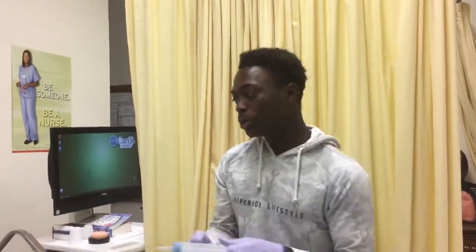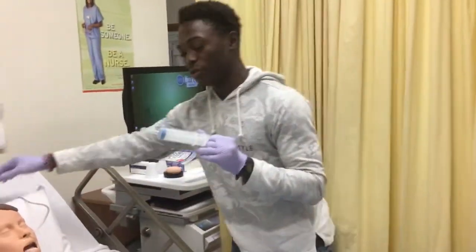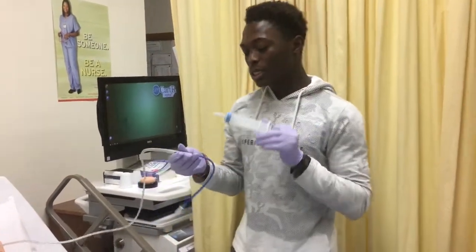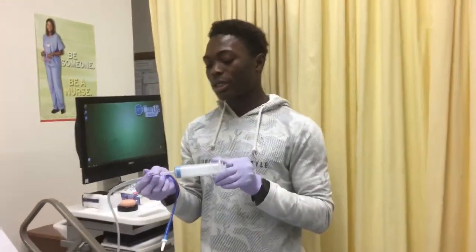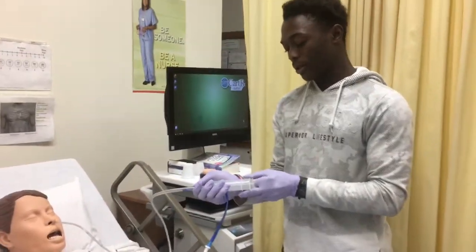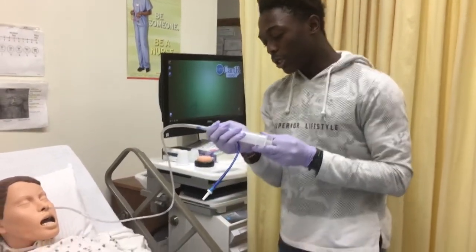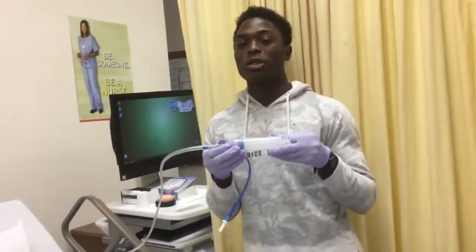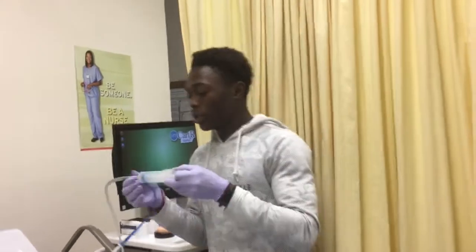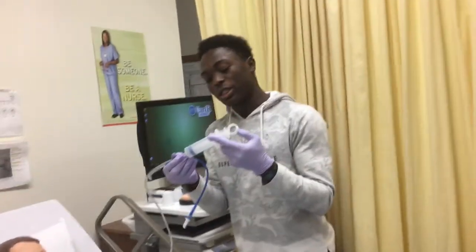So I am going to check for placement of tubing by using my syringe. How you do this is that you use the syringe and put it into this port right here, and you want to aspirate on there to get the content of it. Normal color is gonna look greenish, brownish, or yellowish. So once you do that, you can actually put this back in.